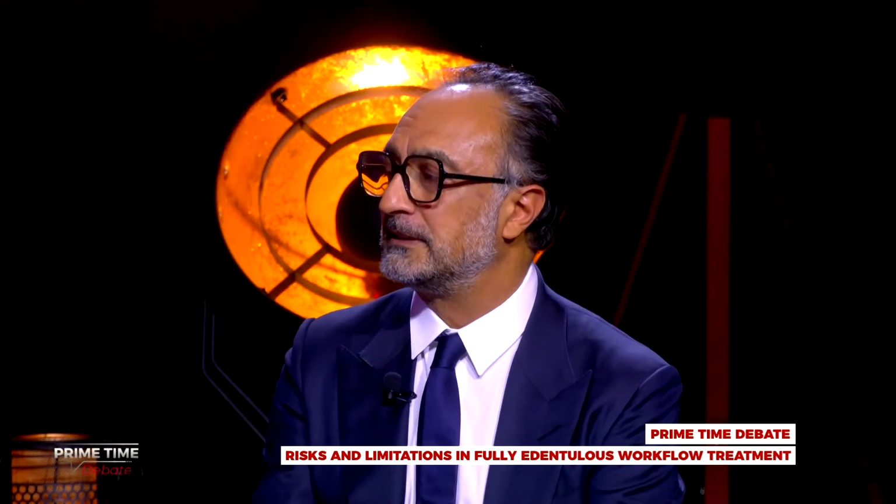So for me personally, I agree with Bjarni a little bit, because why should we go through all those problems, which we can counter and experience, and still do guided surgery? For me it was starting to do guided surgery in fully edentulous cases. Let me be clear, there's a difference between fully edentulous and partially edentulous. For fully edentulous cases, if you really want to go through all this trouble, then for me at least, I want to have a final restoration or at least a temporary restoration already prefabricated.